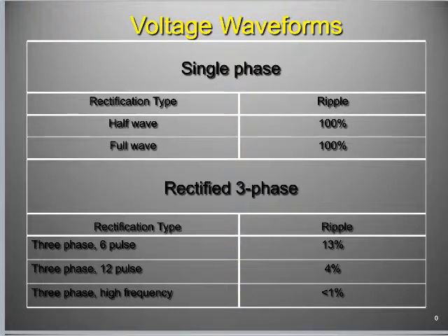So that's what's illustrated here on page 123. The magnet spinning and inducing the pulses in that wire. It's as simplified as possible. We're just spinning big magnets, and those magnets, through induction, are inducing pulses of electricity that are used to power this computer and y'all's computers and everything here in the city of Memphis. That's great. And we're going to use that. We're going to use electromagnetic induction.